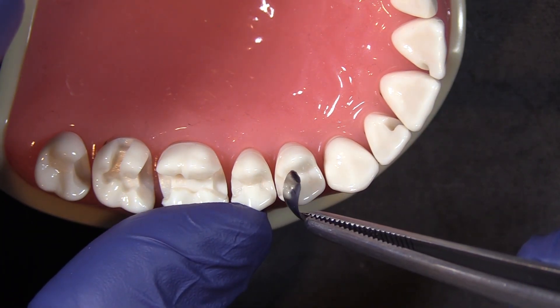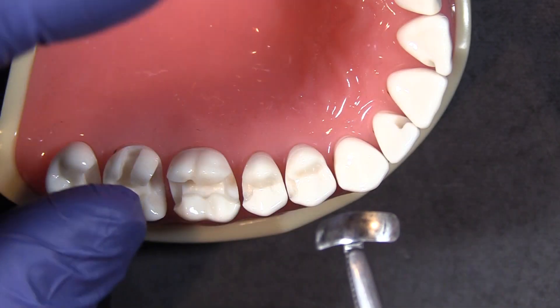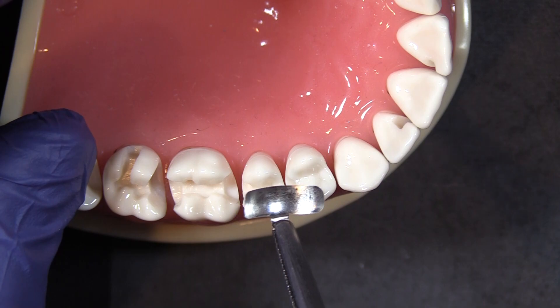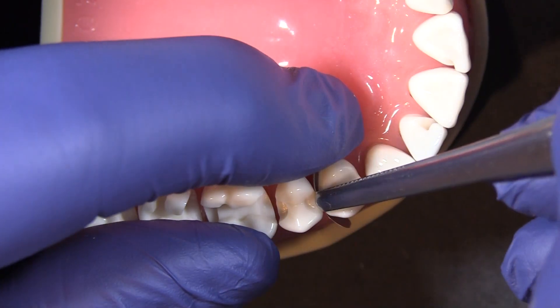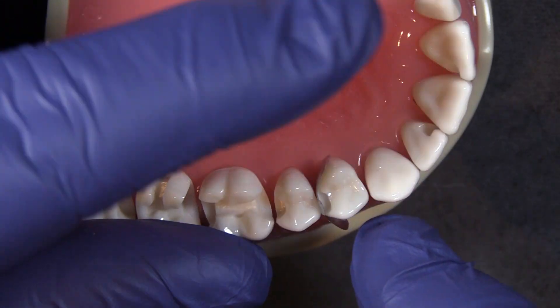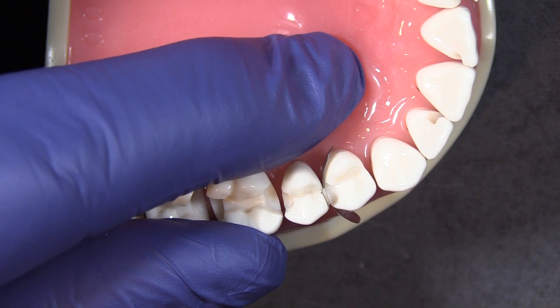I have a fairly tight area between 13 and 14 here, and what I have in my forceps is a composite tight firm band. It is not dead soft, and that allows you to really push on that and get it down in there without deforming. So my first tip would be to use a composite tight firm band.